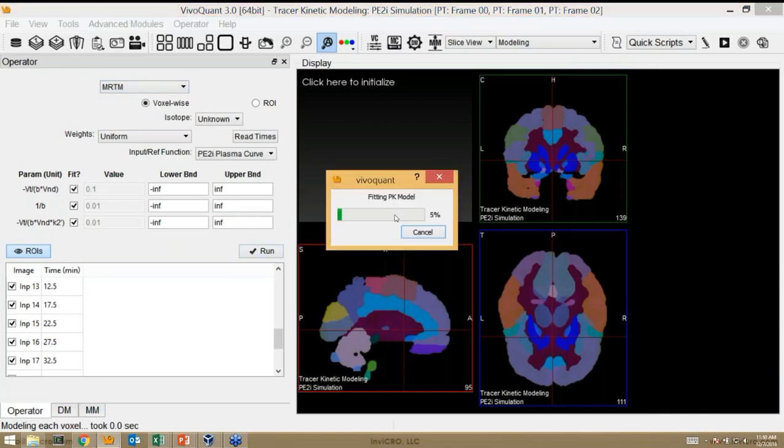This might take a little bit longer, but as I mentioned, at the end of the day, this will be a very nice parametric map of, in this case, the entire image, because I chose not to mask it. And then you can even generate a 3D rendering of that model parametric map, or you could create images. Whatever you really want to do with that can be done once that finishes. This might take a minute, so if there are any other questions, certainly feel free to post them now.